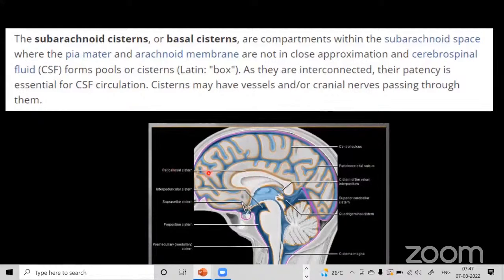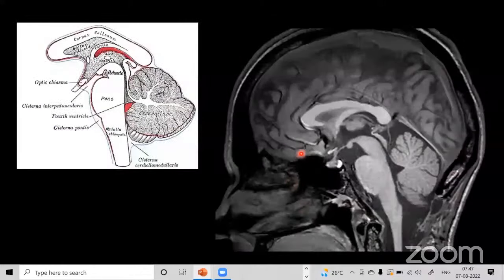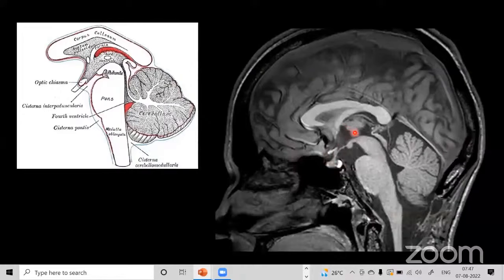On a midsagittal graphical image, at least 11 to 12 important cisternal spaces can be identified. The pericallosal cistern runs along the corpus callosum and is where pericallosal lipomas occur. The interpeduncular cistern is midline and better seen on axials. The suprasellar cistern is around the sella. The prepontine cistern is ventral to the pons. We also see the parieto-occipital, falcal spaces, cistern of the velum interpositum, superior cerebellar cistern, and quadrigeminal cistern — all identifiable on midsagittal MR T1-weighted images.